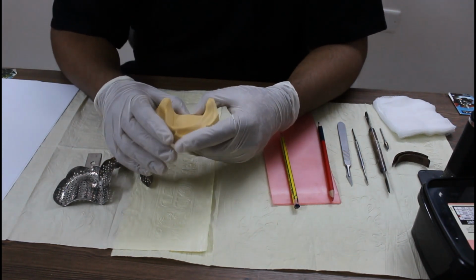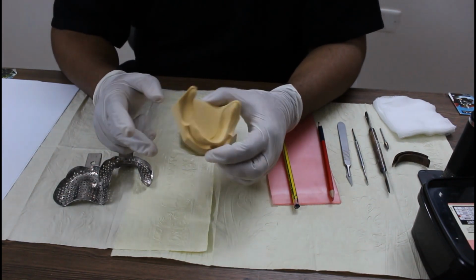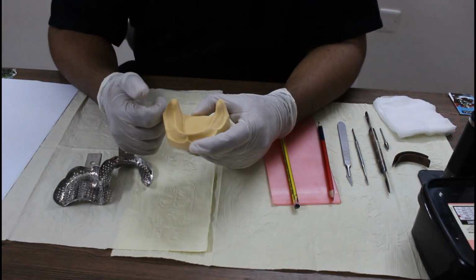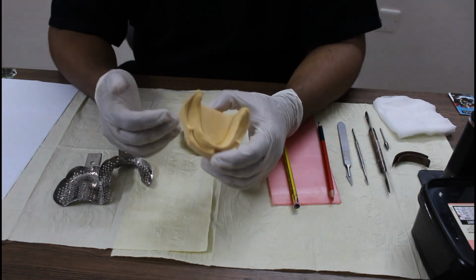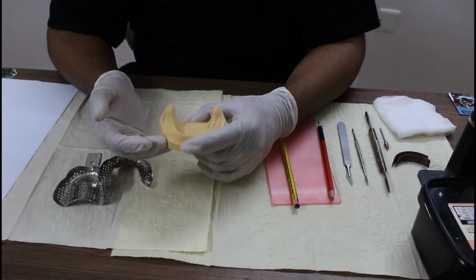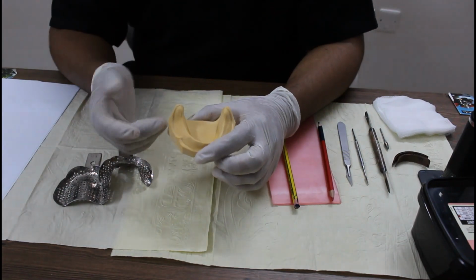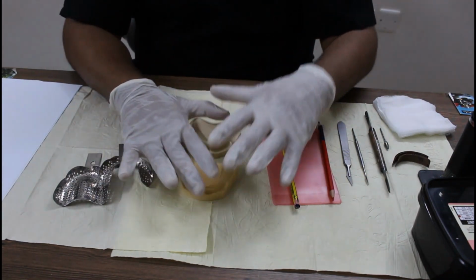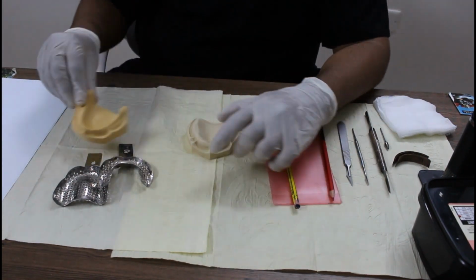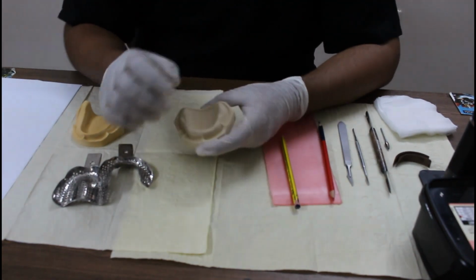It is like, suppose you go to a market to buy some clothes. You have two options. Either you buy a shirt or a t-shirt which is ready, you just buy and wear. The second option is you go to a tailor, give measurements and tell him to make it for you. That means he is customizing that thing for you, so that it fits better. Same way we are making a tray according to this patient. So let's start fabrication of a special tray or custom tray for the maxilla.